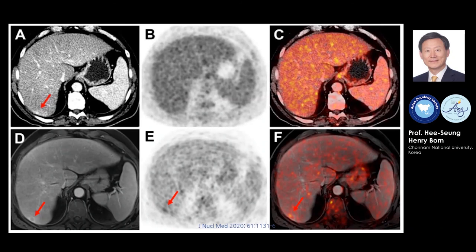This slide shows an intermediate lesion reclassified by PET-MRI — a 53-year-old male patient with lung cancer. Contrast-enhanced CT (A), PET (B), and fused FDG PET-CT images (C) are displayed in comparison to contrast-enhanced T1 MRI (D) and PET-enhanced F18 PET-MRI images (F). On CT, the hyperdense subcentimeter liver lesion in segment 7 is suspicious of a transient hepatic attenuation difference or a small hemangioma; as malignancy cannot be excluded, it requires further investigation. On PET-MRI, the lesion is clearly classified as metastasis due to contrast enhancement and tracer uptake.